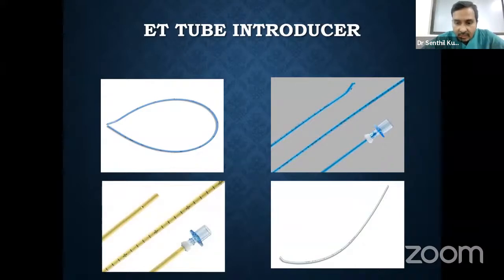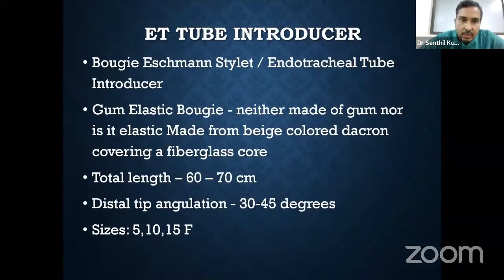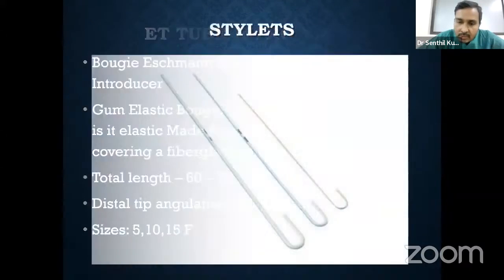When you feel resistance at 35 centimeters, it means that it is going into one of the bronchi. That's why you are feeling the resistance, because of the cartilage rings. Whereas if you enter the esophagus, being a hollow and soft structure, it is not going to provide any resistance and it will go in entirely, even beyond 40 centimeters. When it is going beyond 40 centimeters and you are not able to feel resistance, remember you are entering the esophagus. The other last thing which I am going to tell is the endotracheal tube introducer with slit.